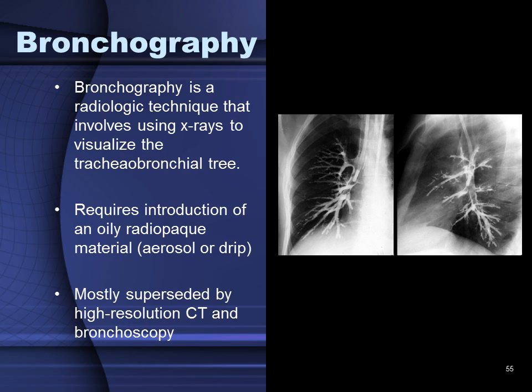So here we have the catheter being inserted into the tracheal bronchial tree, and the aerosol or oily radiopaque material is injected and then adheres to the mucus lining the tree. It is mostly not used now, secondary to the advent of high-resolution CT scan and bronchoscopy.